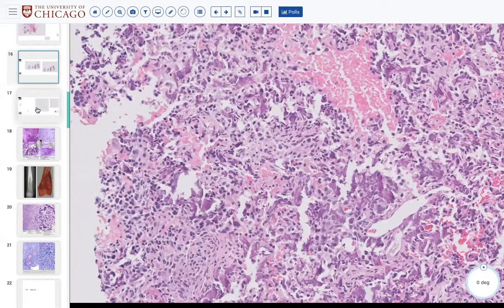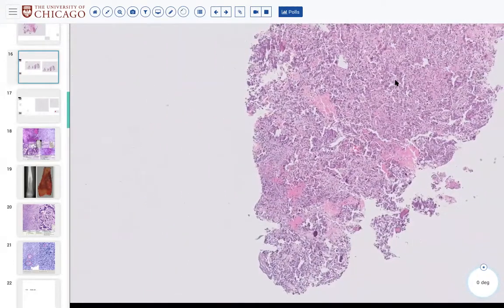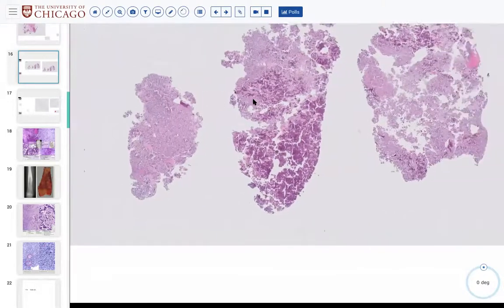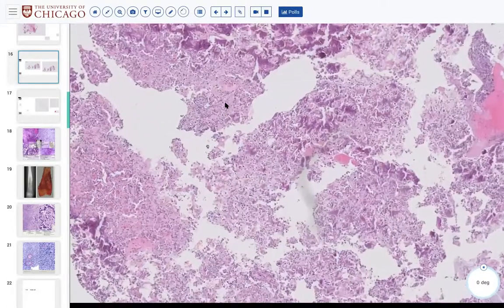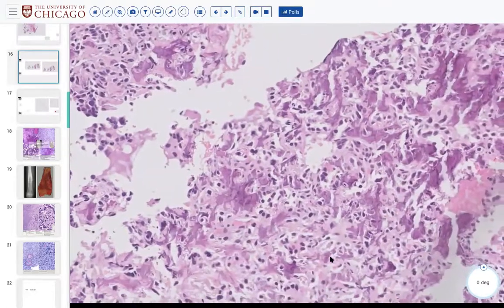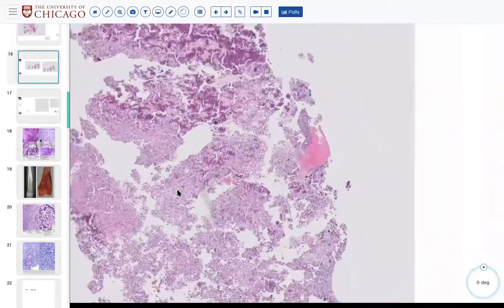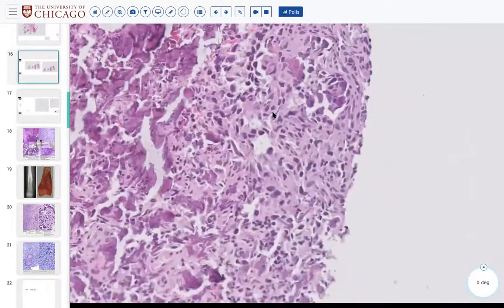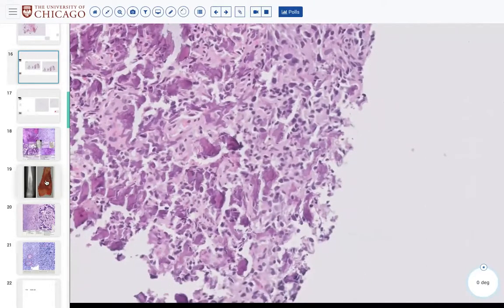Okay, in the clinical question of a chondroblastoma, if this were a clinical question, which it was, of a chondroblastoma, does anybody know the one ancillary test that we could do to evaluate for a chondroblastoma? All right, thank you. So yeah, histone.